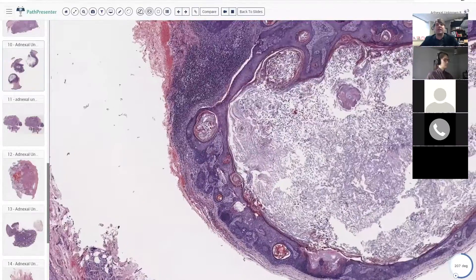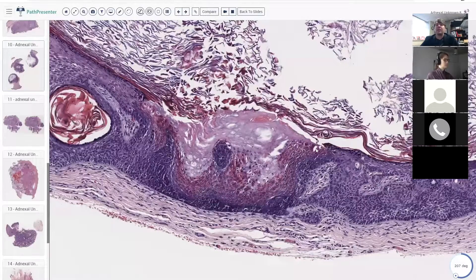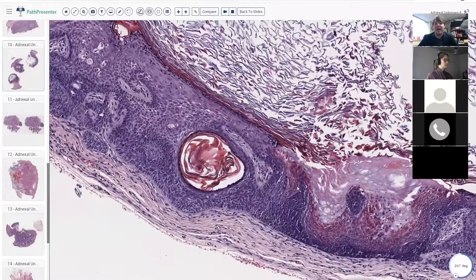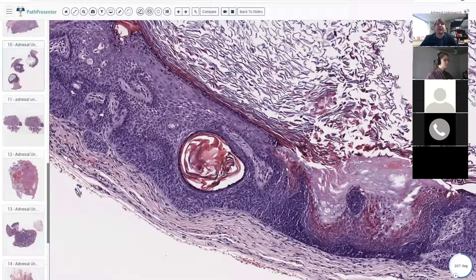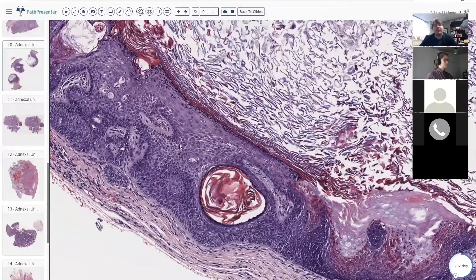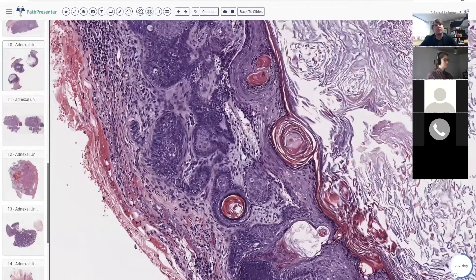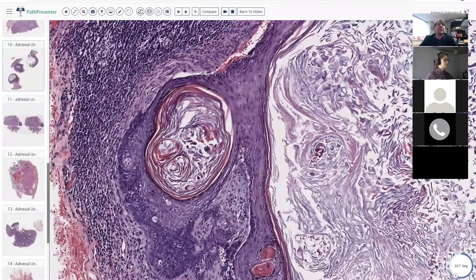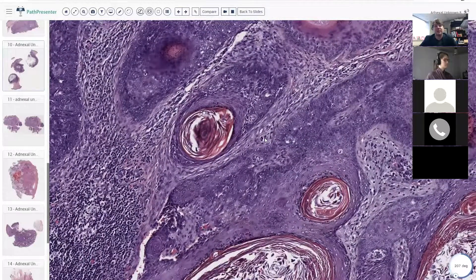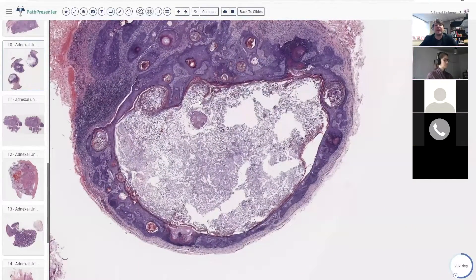I would call this a trichofolliculoma. The other thing you could consider here, because you have all sorts of different types of hair follicle differentiation, is pan folliculoma. Pan folliculomas basically have matrical, outer root sheath, and inner root sheath differentiation all combined together. They can be a cystic nodule deep down or hooked onto the epidermis along the surface — and they're also benign. So if you call this a cystic pan folliculoma, or trichofolliculoma, or trichoadenoma, or even trichoepithelioma with cystic change — it's all benign and okay. Do not be afraid. There are other things we should be worried about. This is not one of them.